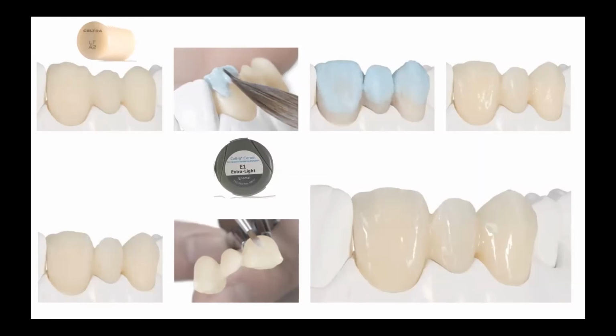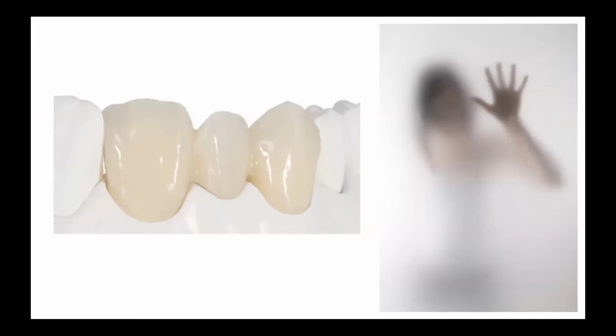and because we will use the enamel for the cutback technique, we can use an LT ingot for pressing of this all-ceramic framework. But please have a look at what we have if we use light enamel for distribution of value. Our enamel third is not very translucent, and if we want to create a beautiful structure of mamelons, this structure will be masked with the layer of this enamel.